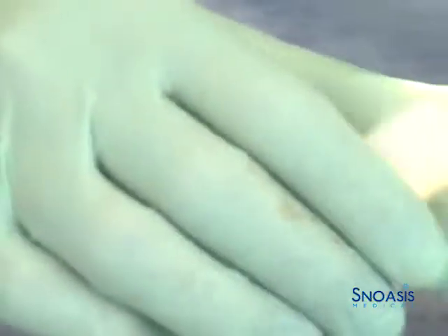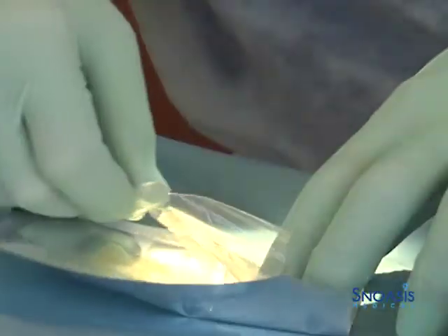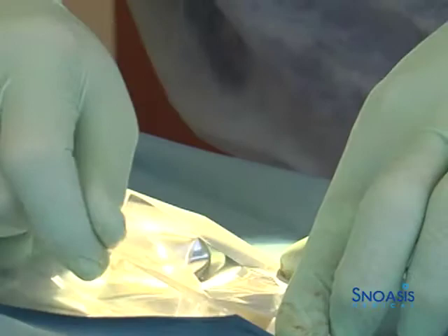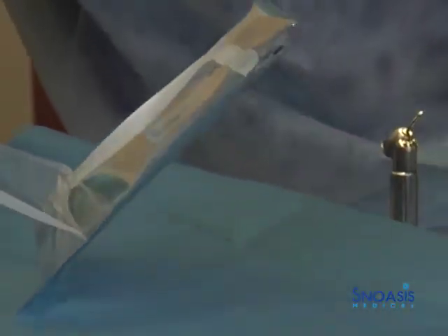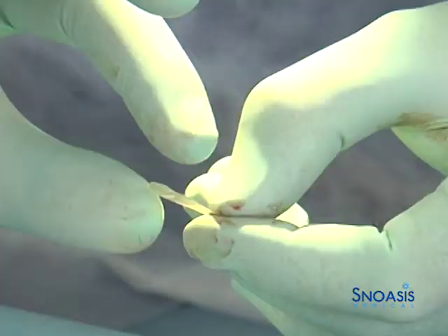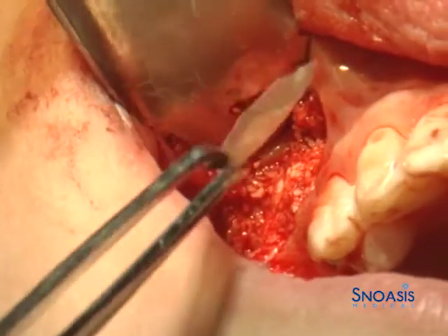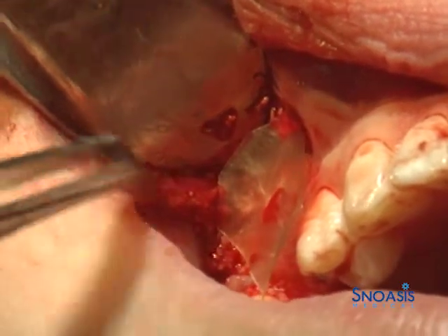This protocol reveals drying of the gloves prior to handling of the bio-exclude membrane with cotton gauze. The bio-exclude membrane is opened from its packaging and is held with dry hands, as handling of the membrane is best served with dry gloves to prevent sticking. The membrane is fragile in its initial state, but as it absorbs blood it becomes significantly tougher. This image shows a trimmed bio-exclude membrane consistent with prior protocols.